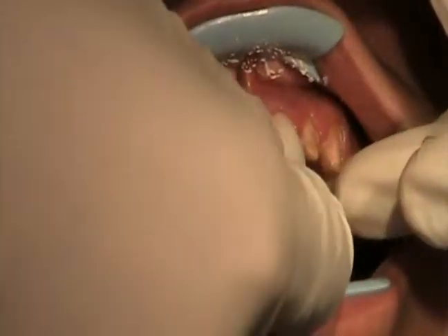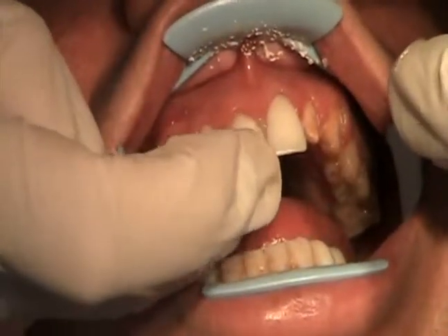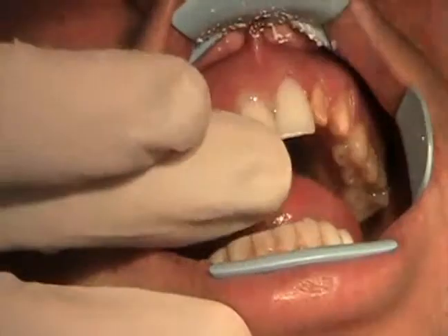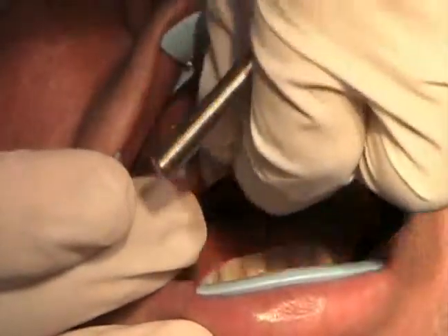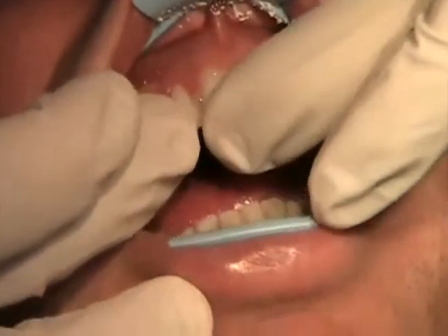But mainly it has to be held on just by the friction of the preparation. That's why the preparations have to be done the way they are — where they're reasonably parallel, but not exactly. We've got to make sure when we cement it's got to be perfect before we let that cement set.